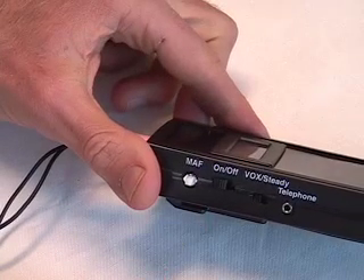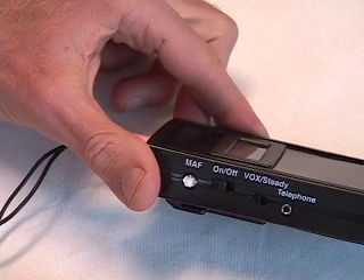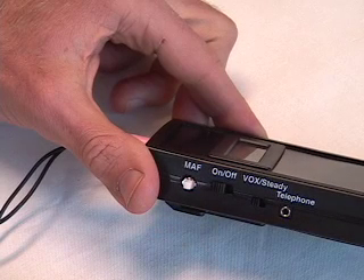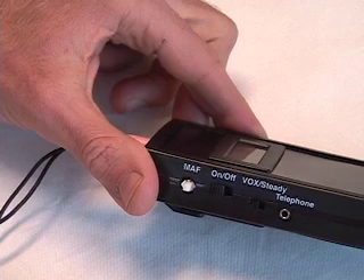If you get into a silent block where you can't make a sound, DAF and FAF don't help. But you can push the masking button, and the device generates a sine wave imitating the sound of your vocal folds vibrating. This should fool your brain into thinking that your vocal folds are relaxed and pull you out of the block.